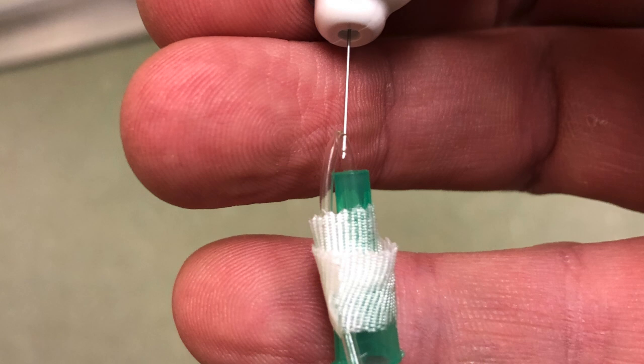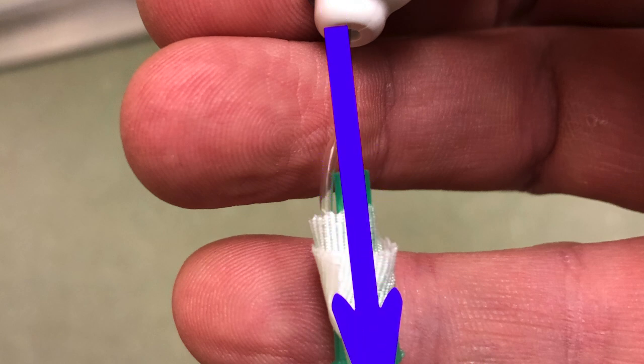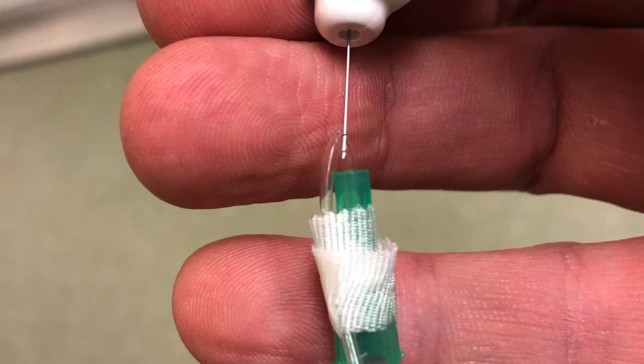Next, take an insulin syringe and poke one hole in the tubing. Do it just proximal to the kink you made when you folded it. Try your best to align the needle from anterior to posterior along the axis of the angiocatheter, and not perpendicularly.